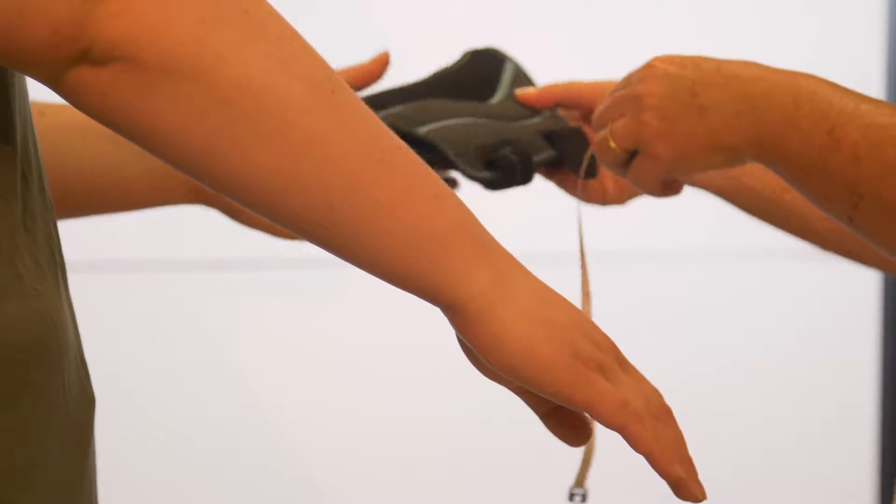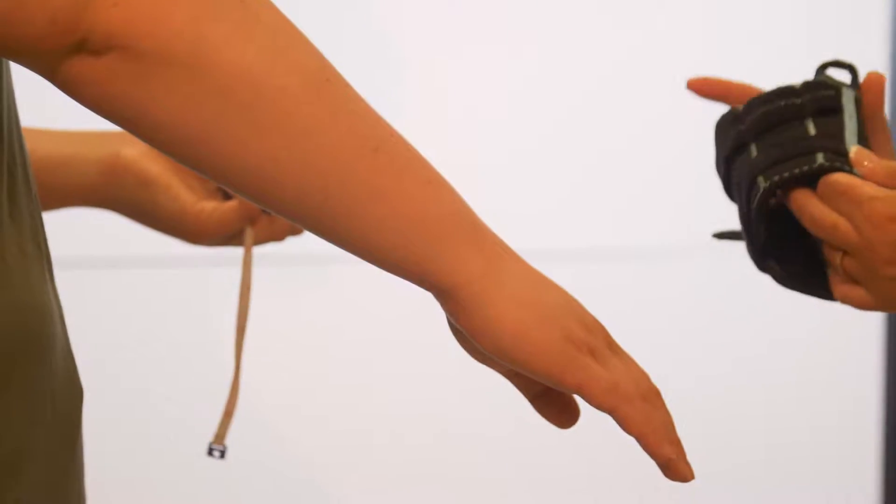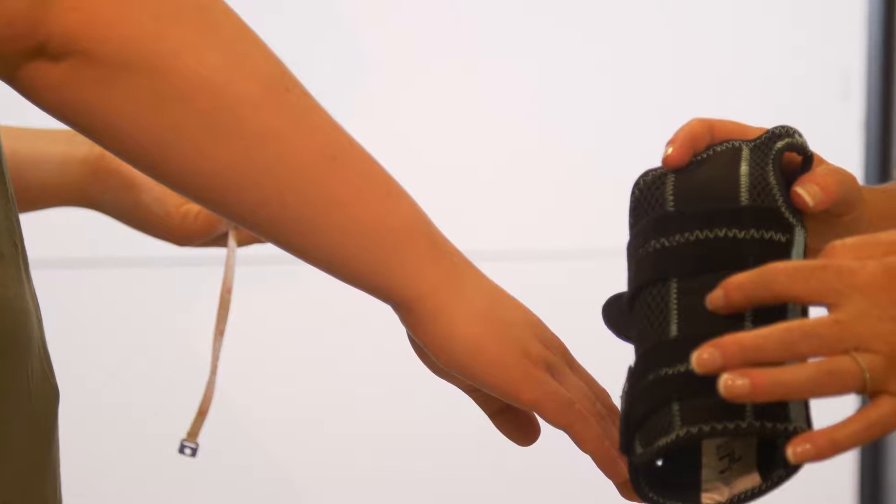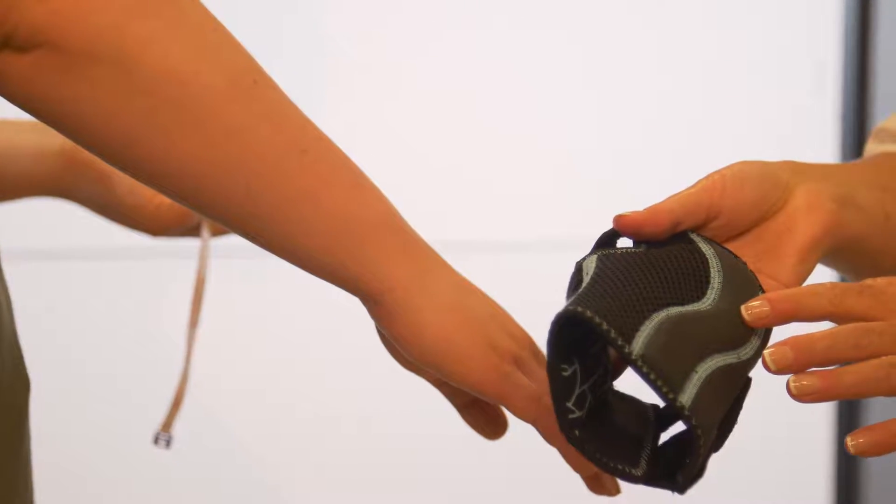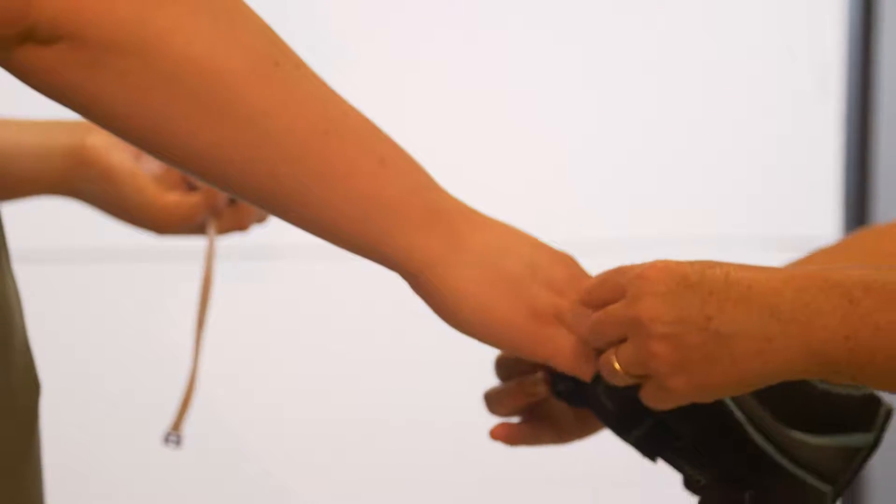Compare this measurement to the sizing chart in the package to determine the corresponding size. There are two rigid stays in this brace: a curved stay on the palm side of the brace and a flat stay on the back.